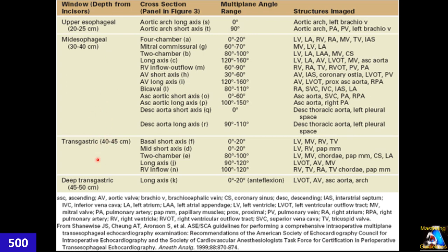Always pay attention to your image. Each patient has different anatomy and location, so it will be variable. So based on the view that you see, you have to adjust the location of the probe. Here are those angle rotation parameters that later we talk about.